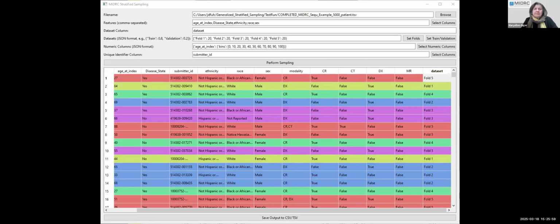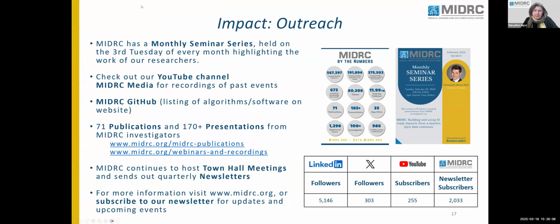Okay, next slide then. Okay, so I want to thank Hui and Jordan for going through these 4 tools: the React tool, the MIDRC metric tool, the AI reliability tool, and the stratified sampling tool. Keep in mind these were built for MIDRC and now generalized so everyone can use them. And I thank them for giving that user perspective of how to approach these. If you're lost, just start at midrc.org.